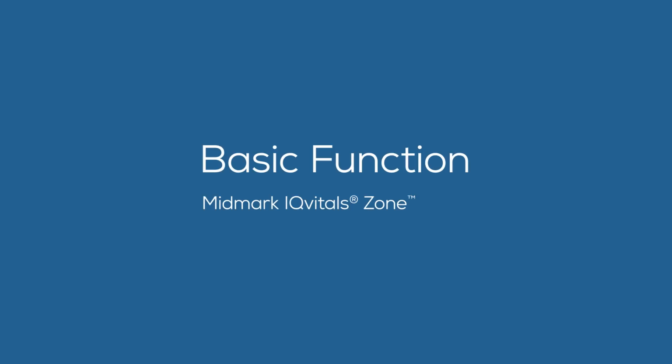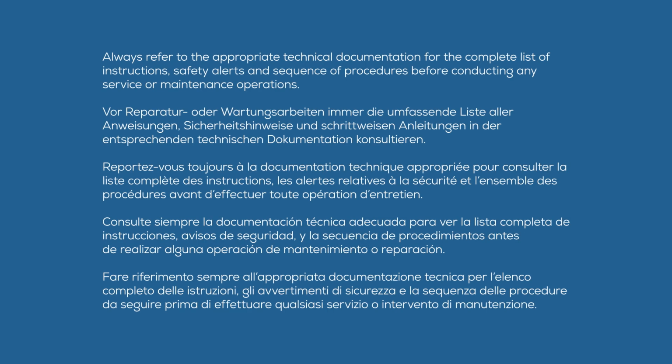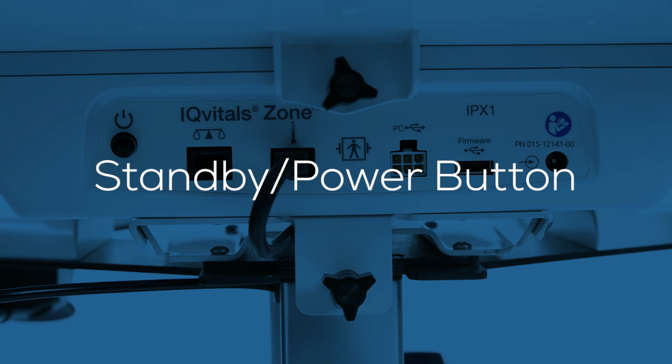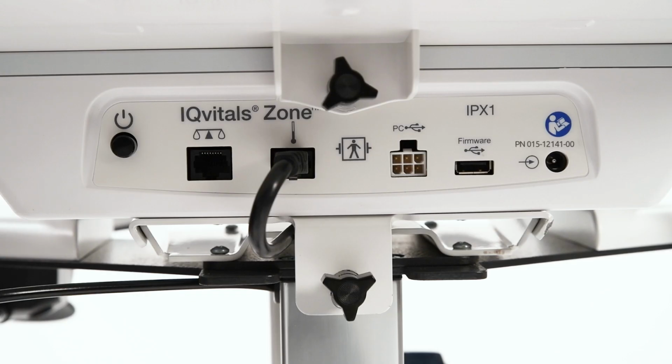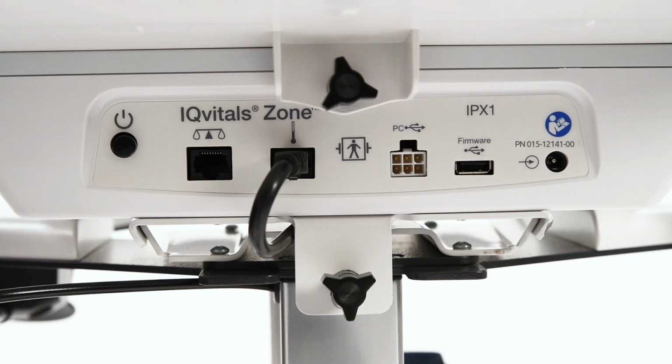This video is an overview of the basic functions of the Midmark IQvitals Zone Vital Signs device. Always refer to the appropriate technical documentation for the complete list of instructions, safety alerts, and sequence of procedures before conducting any service or maintenance operations. Standby power button. To activate power to the device, press the standby power button on the back of the device.